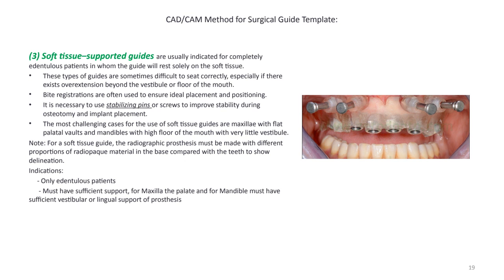Therefore, those surgical stents that use tissue as support use pins that are attached into the soft tissue, allowing the stent to be more stable.